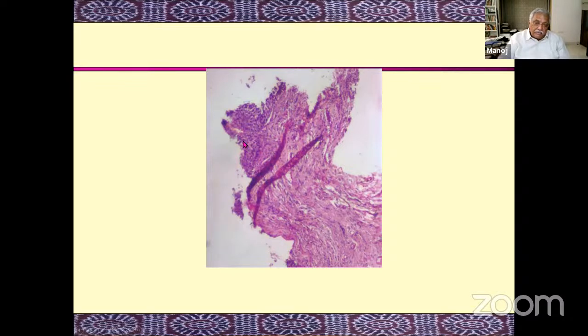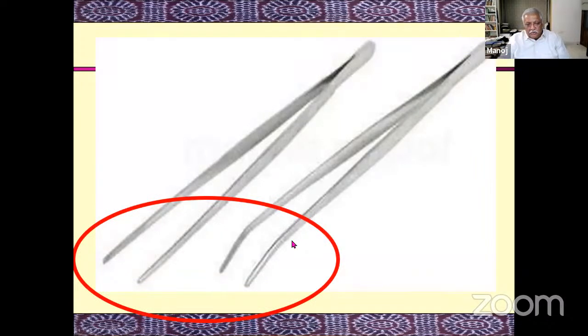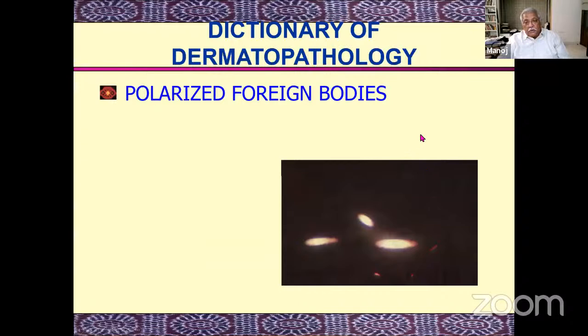This is the epidermis. This is some part of the dermis. There is inflammation. That's all you can say. You cannot make any diagnosis in this. So always stick to plain, simple forceps. Maybe even use a needle that will leave only a hole. Try and avoid brute forceps. Thank you.